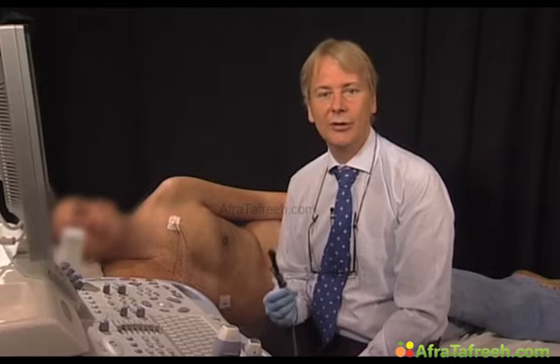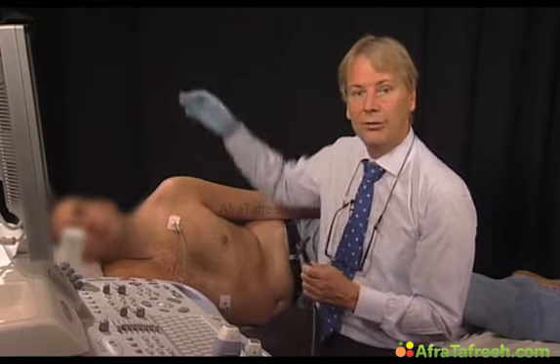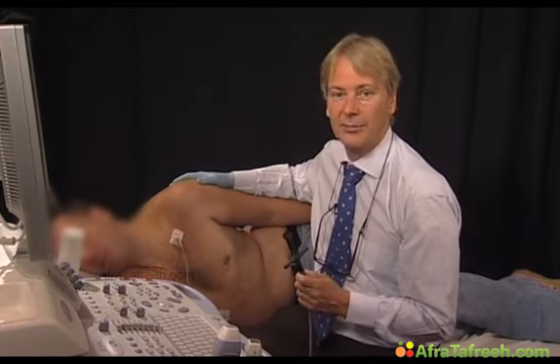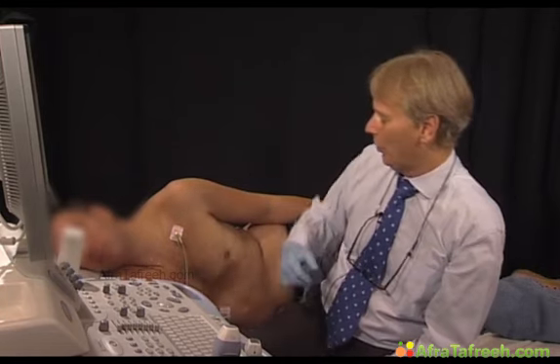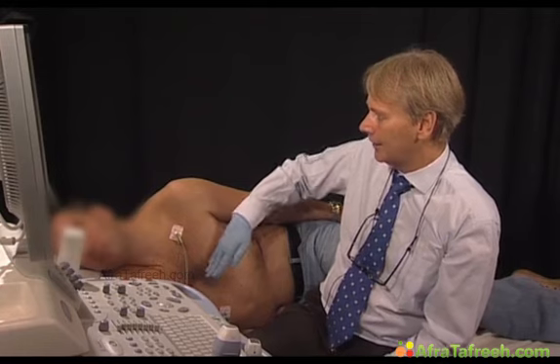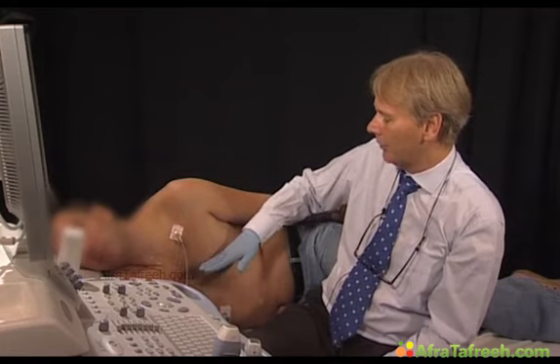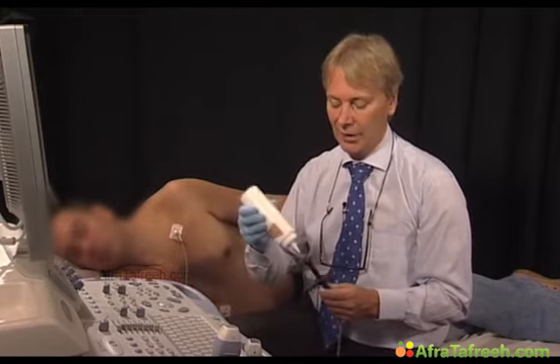To quantify aortic stenosis from a right parasternal approach, we also need the pencil probe. It is also important to position the patient turned as far as possible towards the right. And then we have to remember what the anatomy of the heart is and where we can actually expect the jet to go. So the heart is here on the left side, and the jet can go in many directions. It can go fairly flat, but it can also go fairly steep towards the head. So we have to try more positions and more windows and try to see where we get the optimal signal and the maximal velocity.